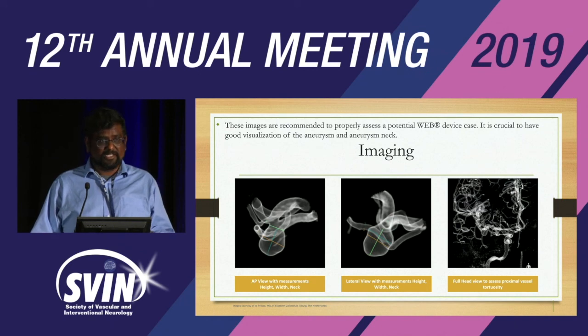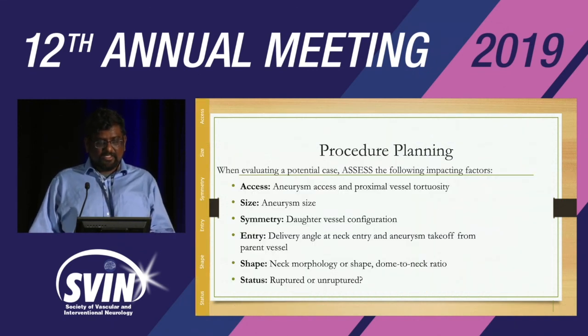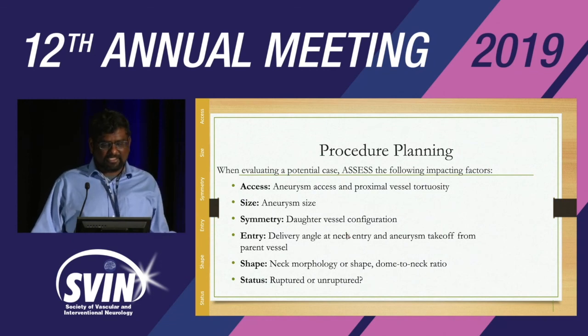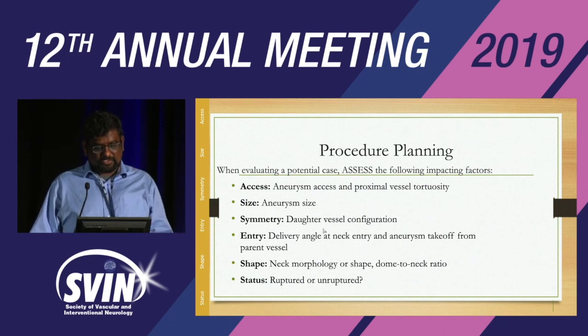It doesn't need to be transparent, translucent, all these things. They don't make any difference. And when we think of the planning, we have to think about the aneurysm size. Just went through that. You have to think about, is this a regular appearing aneurysm? Does it have a bleb on the side? Does it have a bleb at the neck? We'll go through some of those things.